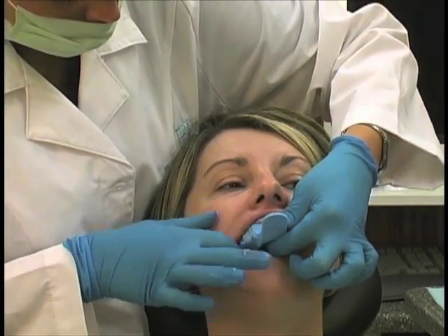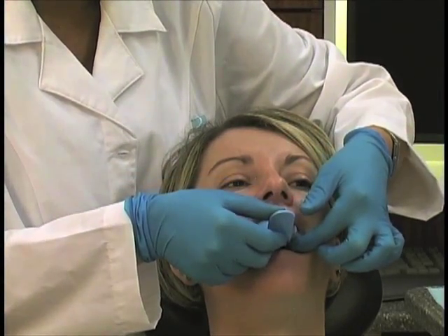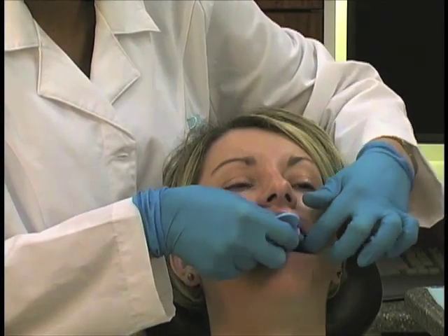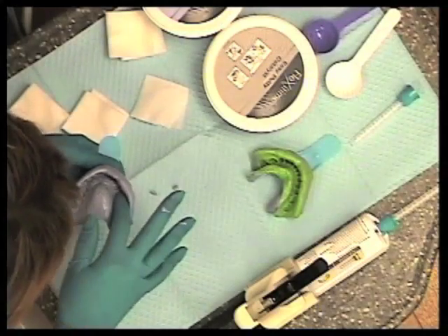And again, all we're trying to do here is create that custom tray. We'll wait our 20 to 30 seconds for it to get flow where it needs to flow. And we can pull that right out of the patient's mouth. And again, the same thing.